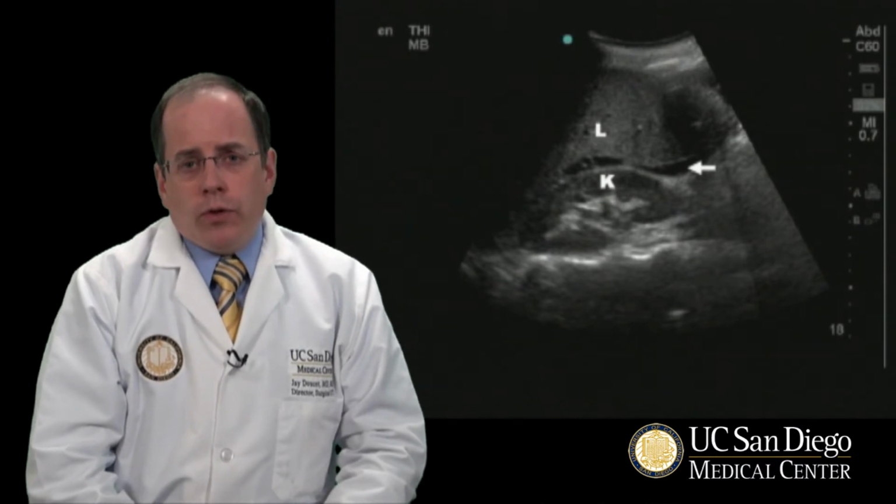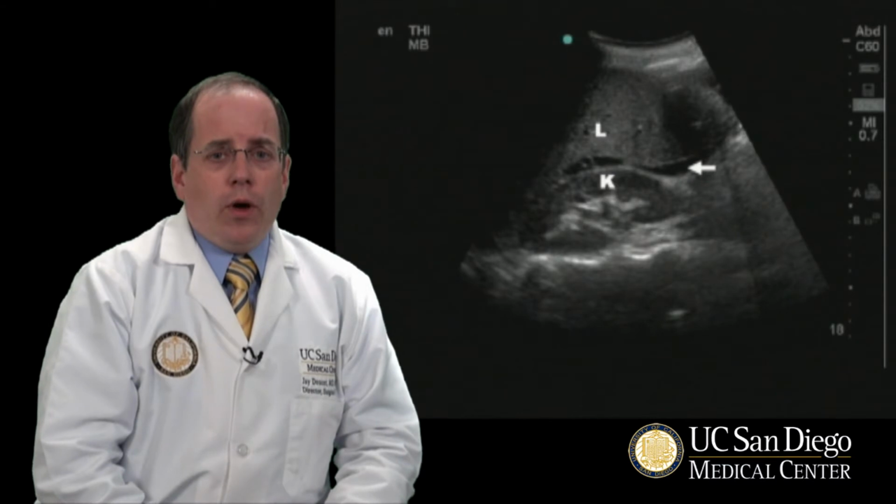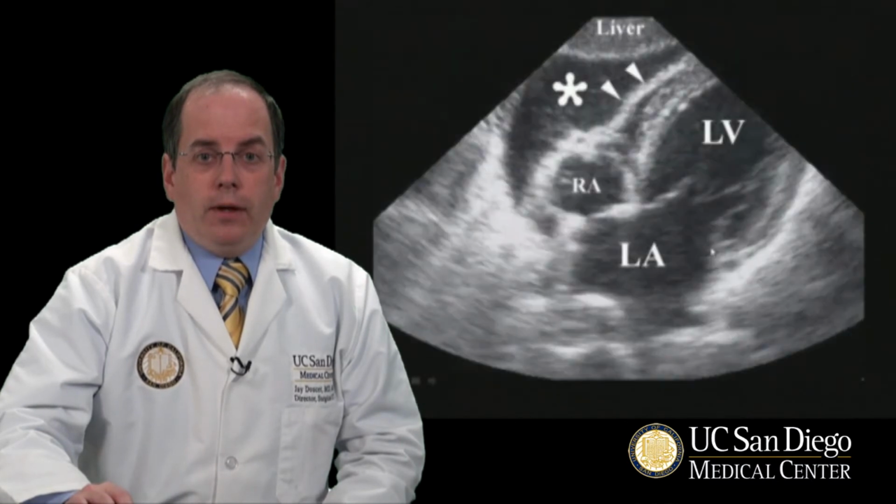Here's an example of a FAST exam looking at Morrison's pouch, which is usually the first window examined. The L stands for liver and the K is for kidney. Between the liver and the kidney is Morrison's pouch, and normally you'll see the liver sliding over the kidney without any fluid present. However, in this plain ultrasound film, you'll see that there is in fact fluid sitting between the liver and the kidney. This would be considered a positive FAST exam for trauma.